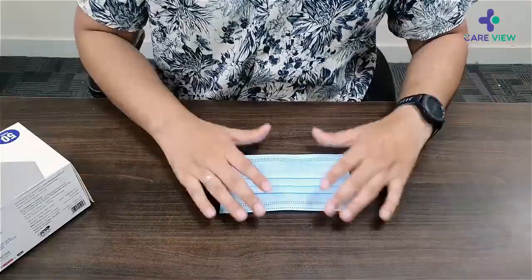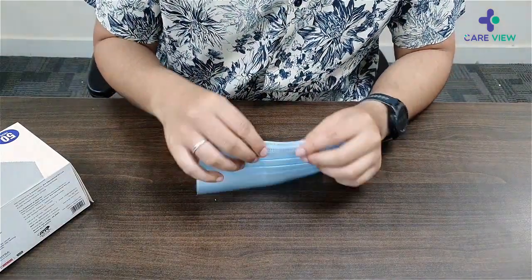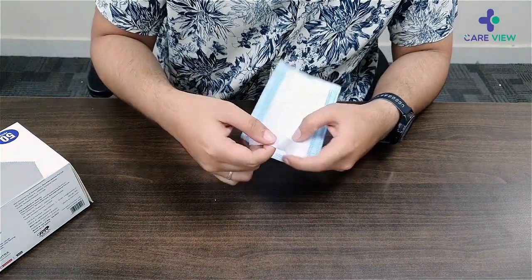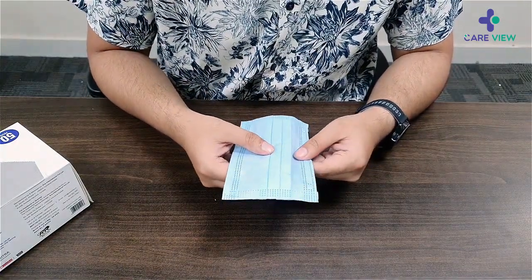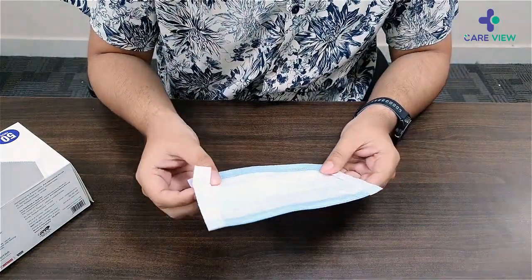Here is the mask — it looks very comfortable and has very soft fabric. It also has an adjustable nose pin. I really like these soft ear loops. It has three layers of protection, which is 99% effective.